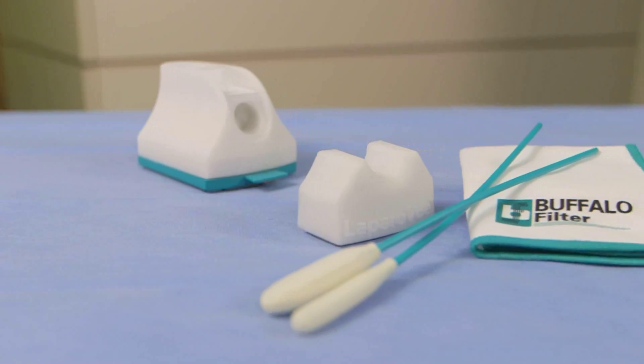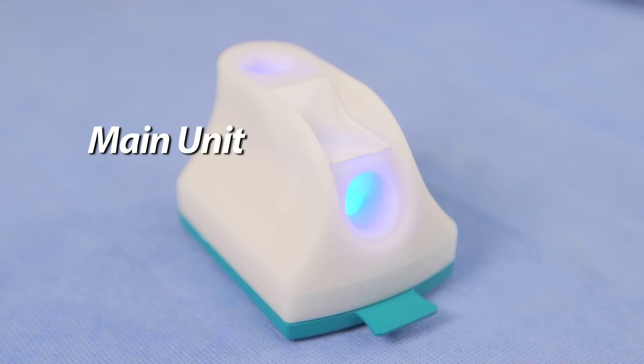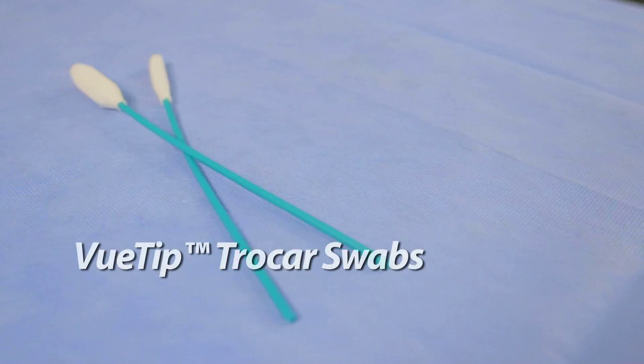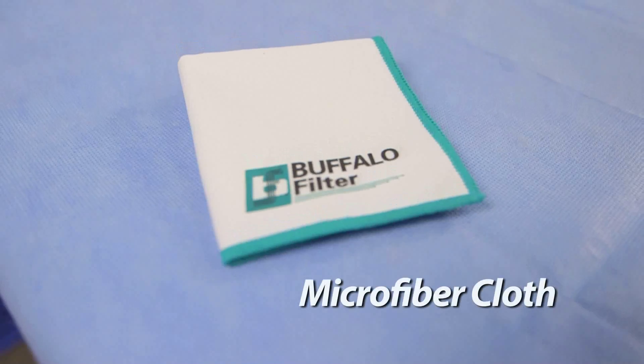Each LaparoVue Visibility System comes with the following: main unit, detachable scope cradle, two VueTip trocar swabs, and a microfiber cloth.